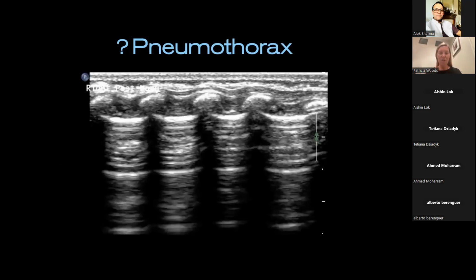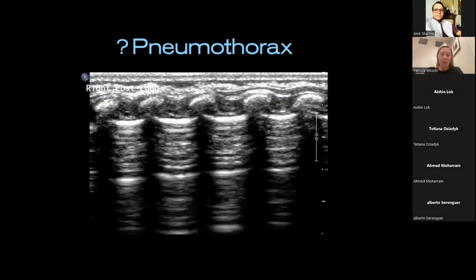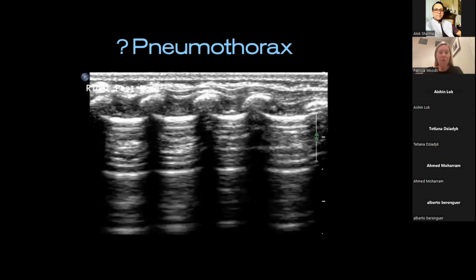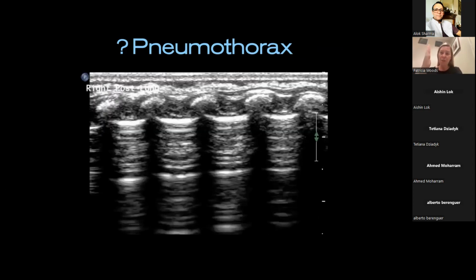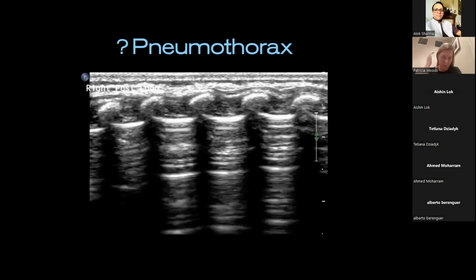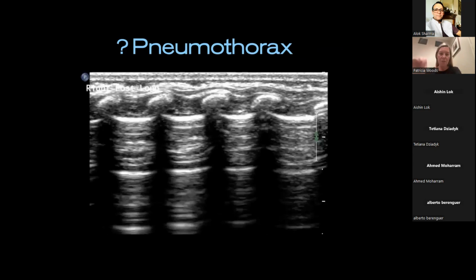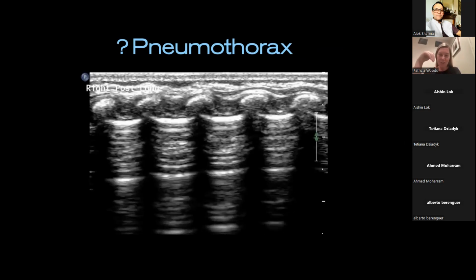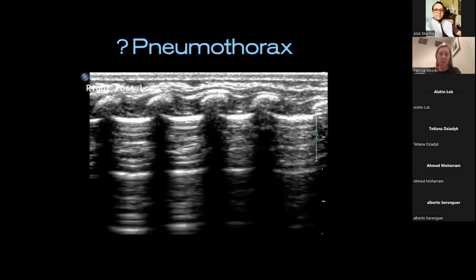All right, I want you to stare at the screen. Think about this. If I gave you this picture of right posterior longitudinal, so this is a baby nursed prone. So my probe is in a longitudinal plane, notched towards the baby's head always. I've come away from the vertebrae. I'm interested in chest wall, little rib shadows, which are like curves at the moment. You've got your lovely bat signs there with the posterior rib shadows.